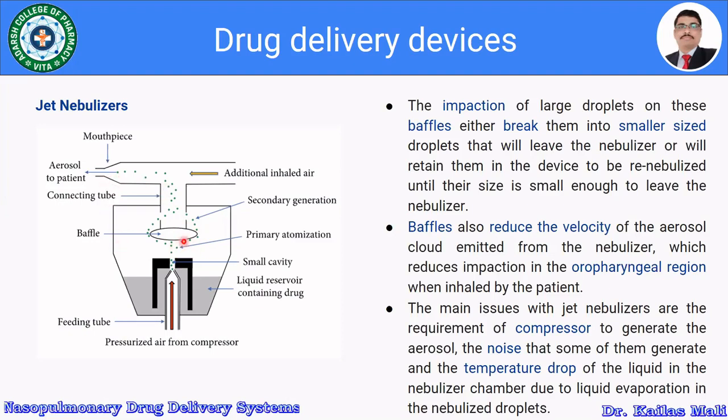Baffles also reduce the velocity of the aerosol cloud emitted from the nebulizer, which reduces the impaction in the oropharyngeal region when inhaled by the patient.